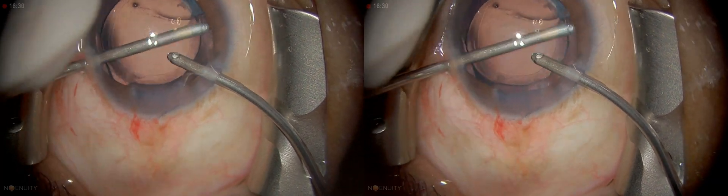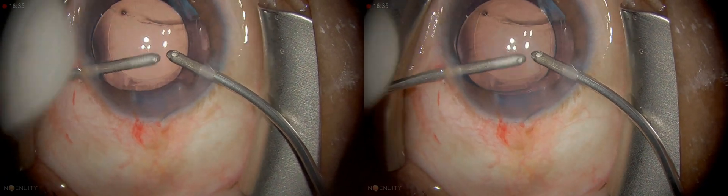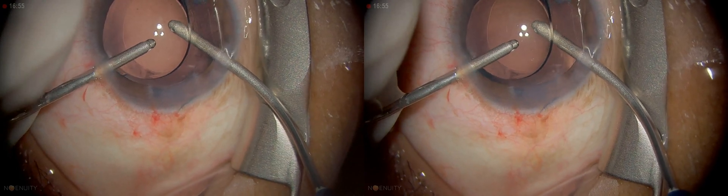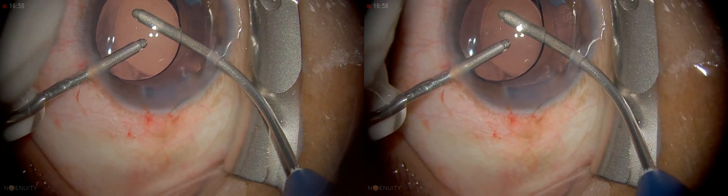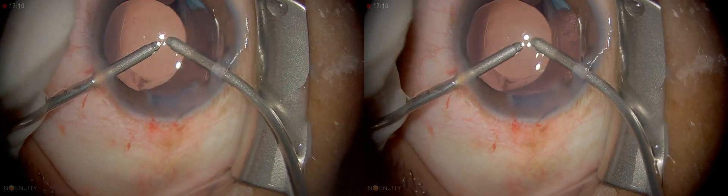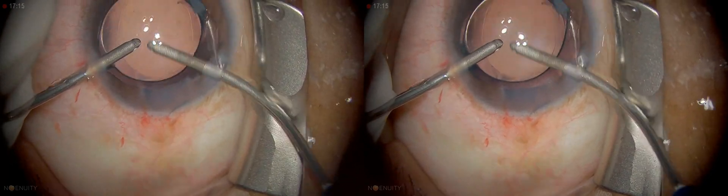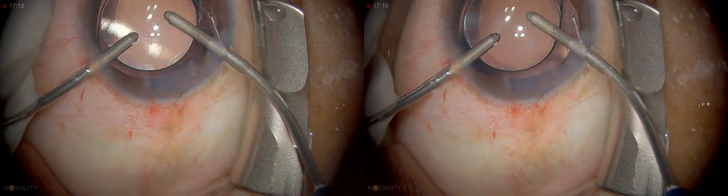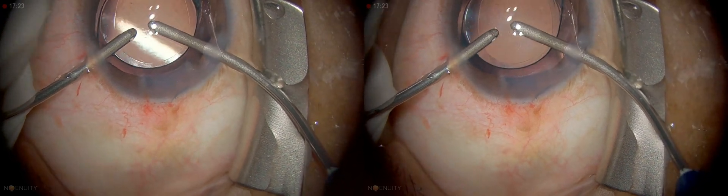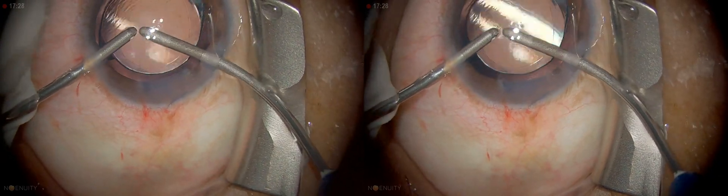This patient has a little bit of fibrosis. That's a little tricky because the vitreous pressure is a little high in this patient. I'm going to leave the haptic here, because if the fibrosis progresses later on it can cause a shift of the lens. So the haptic will give some protection.